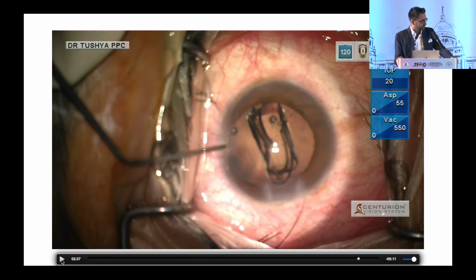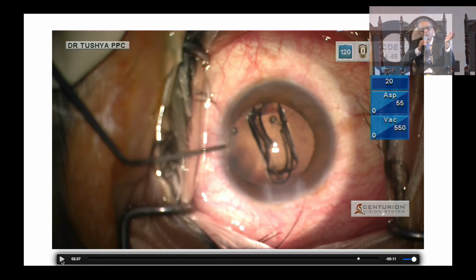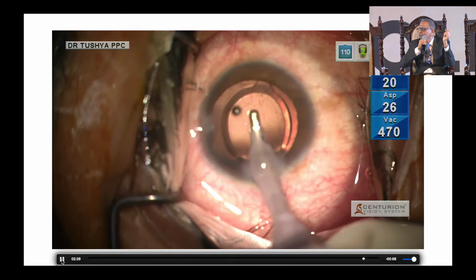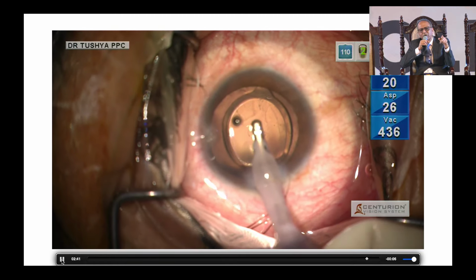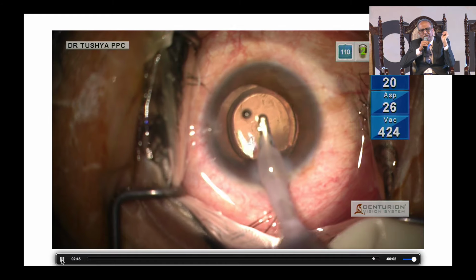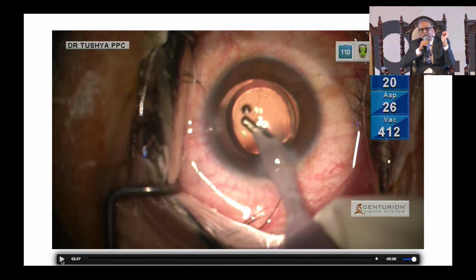And if the patient is young and you feel that you would not be able to do YAG laser capsulotomy in this patient, in that case also you should try to avoid removing the plaque. Yeah, because the PC is so thin in these cases. But I think this is a false positive, because it was a moth-eaten type. Moth-eaten type, in the paper it showed 100% pre-existing PCR, but there was a high predisposition definitely.